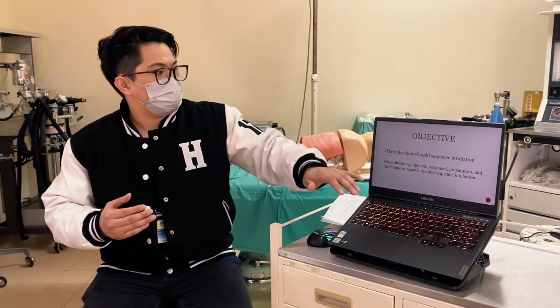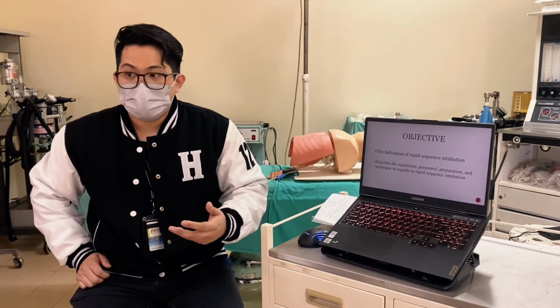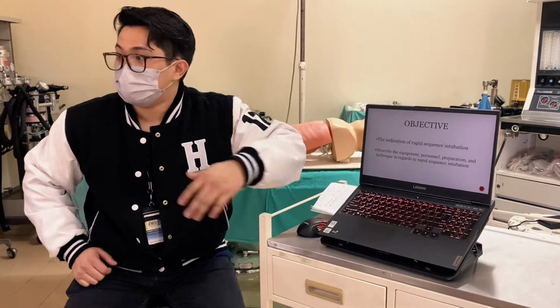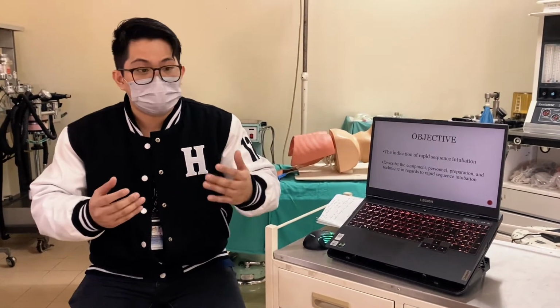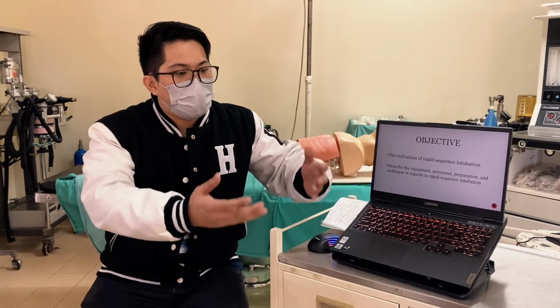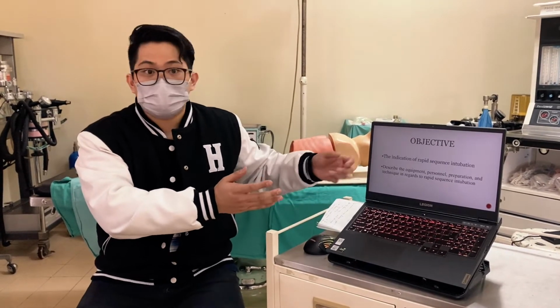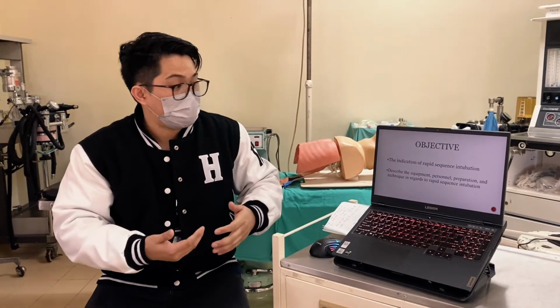The second objective is to describe the equipment, personnel, preparation and technique in regards to rapid sequence intubation. Preparation means what equipment and what kind of patient we need to prepare. Do we need to put two lines in the patient, or do we need a certain type of laryngoscope for this patient? What do we expect? That's what is meant by preparation.